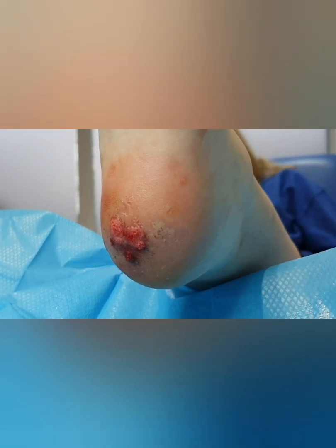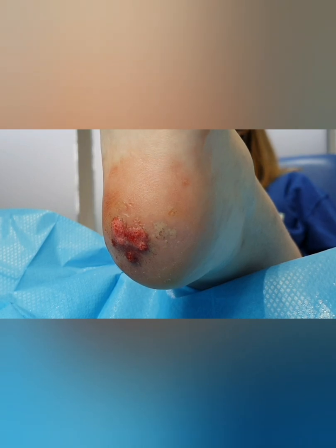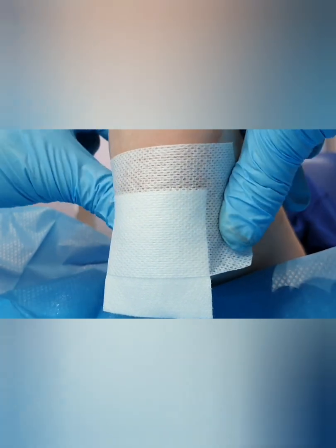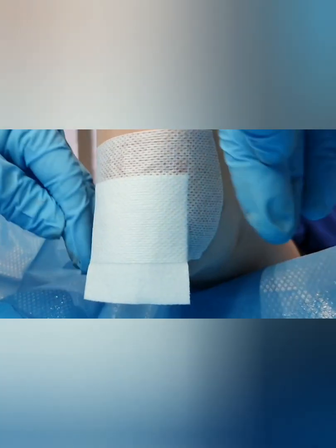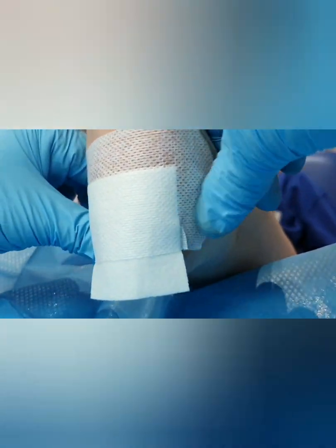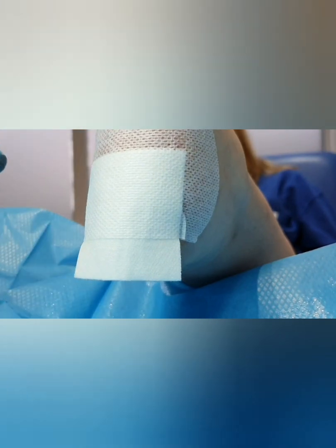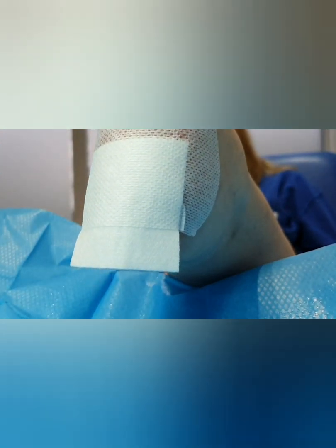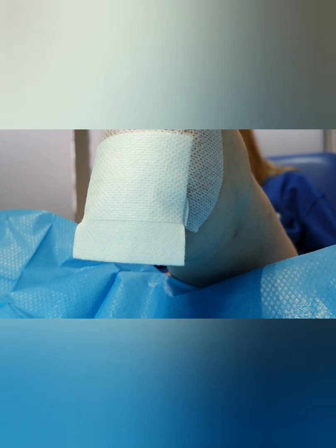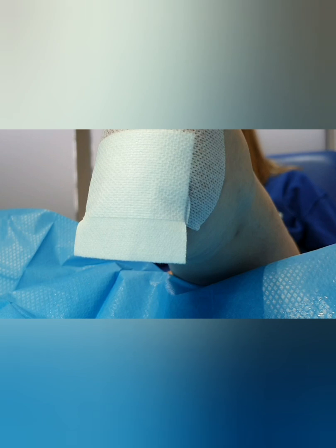I'm going to just dress it with a nice clean dressing, and we'll see the lady then in a week to 10 days. She just keeps that on for the next day or so and can redress with just a dry dressing. It's nothing fancy, it's literally just a plaster. The anaesthetic lasts for an hour or so, and then she can just treat it as normal after 24 hours.